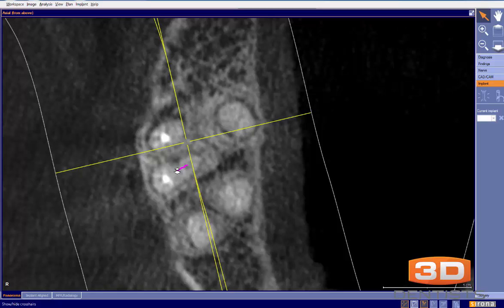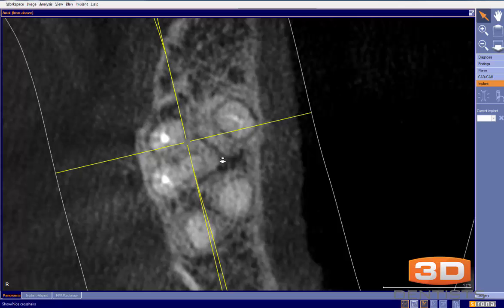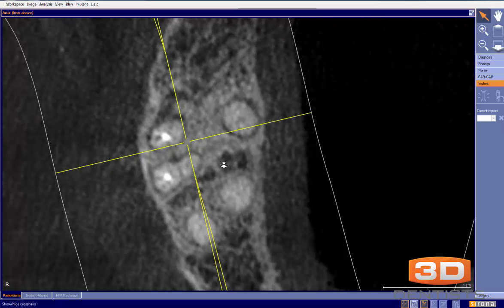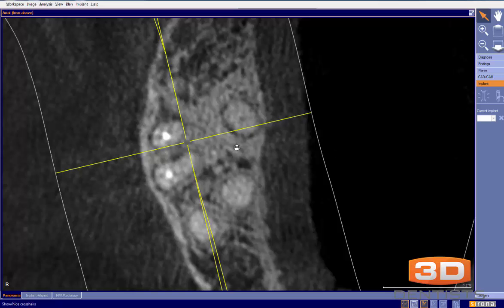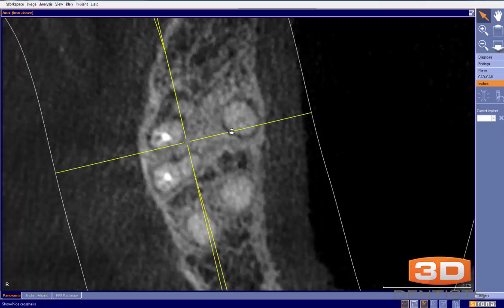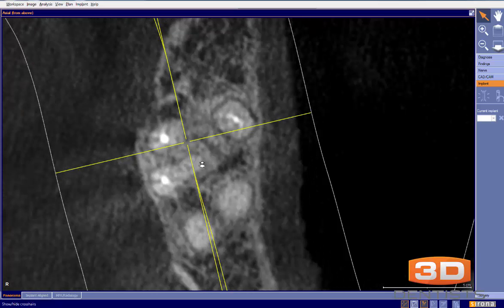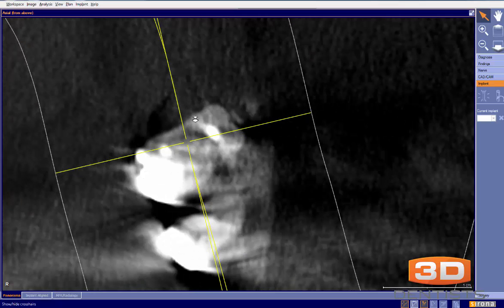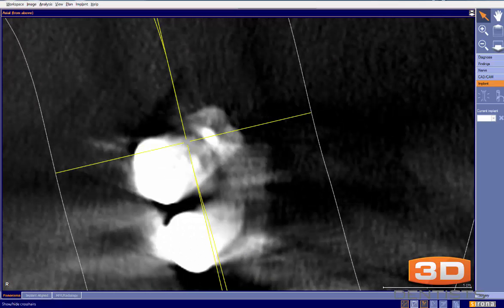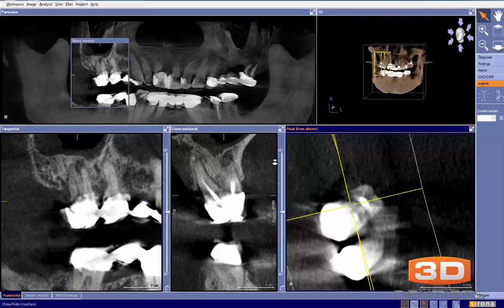I can see the missed canal right here, so I would say retreatment is indicated. I also question whether the palatal root is completely filled in this case. It looks like the palatal root may be a hair short, because we can continue to see that canal running through there.